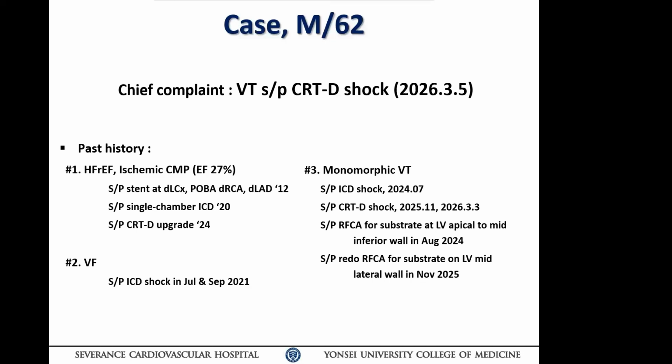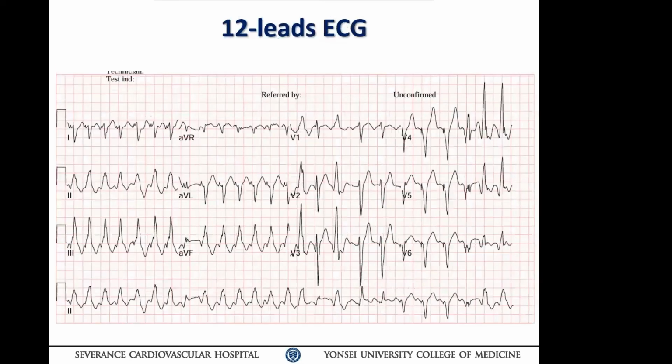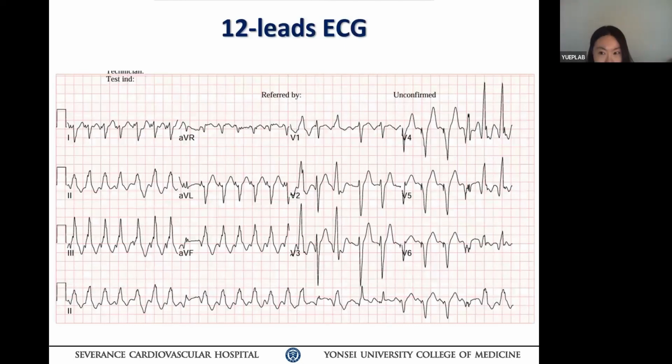Before you say, can you go back there? Good morning. So why is the rhythm irregular? That's the first question. Second, how many QRS morphologies do you see? You already figured a couple of beats are paced, so the patient has a device. In that setting, if this was VT, why so irregular? Can you tell me what the mechanism of VT is then?